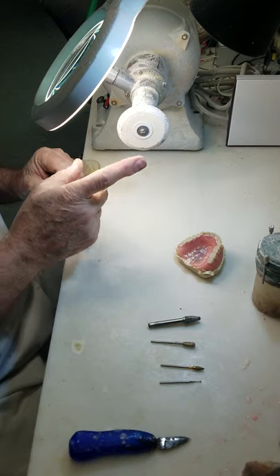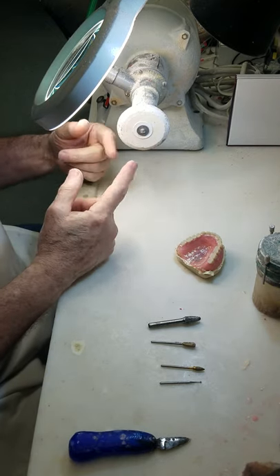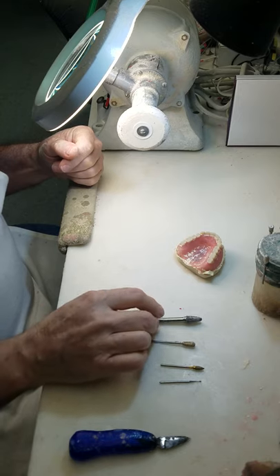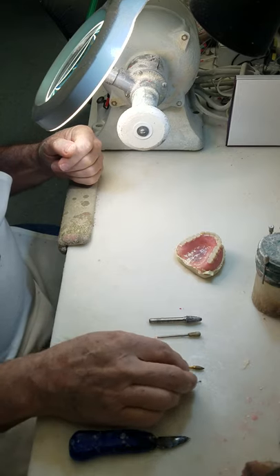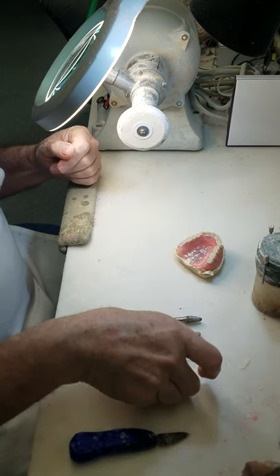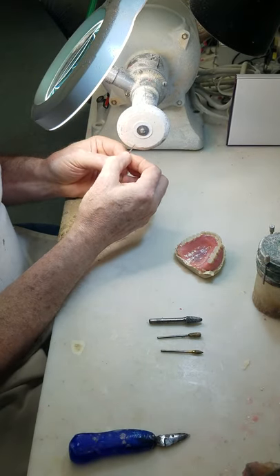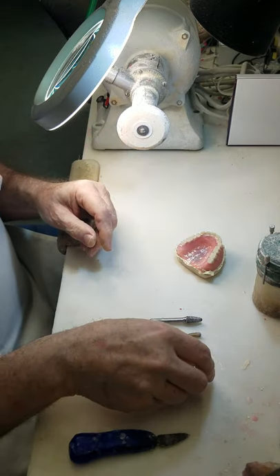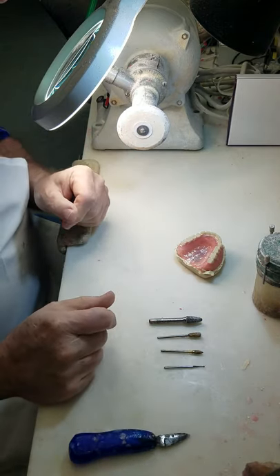My tools are the Big White Wheel — I like the bevel-edged, you'll see why — and pretty much these four burrs. This is a number five burr that I have flattened one side of to use as my stippling burr, and I'll explain that more when I get to that part.